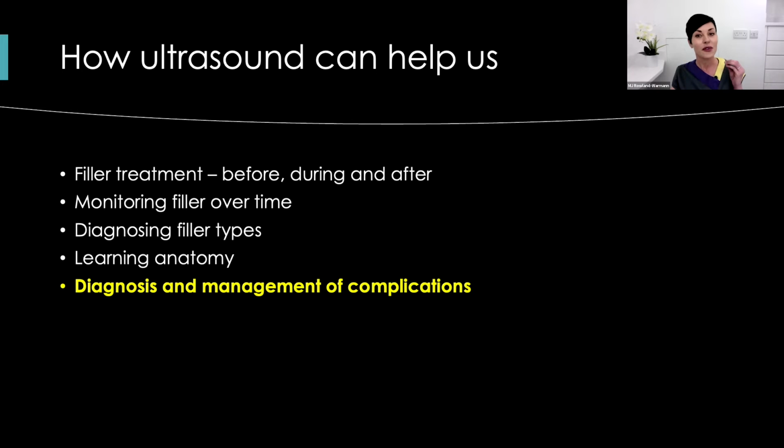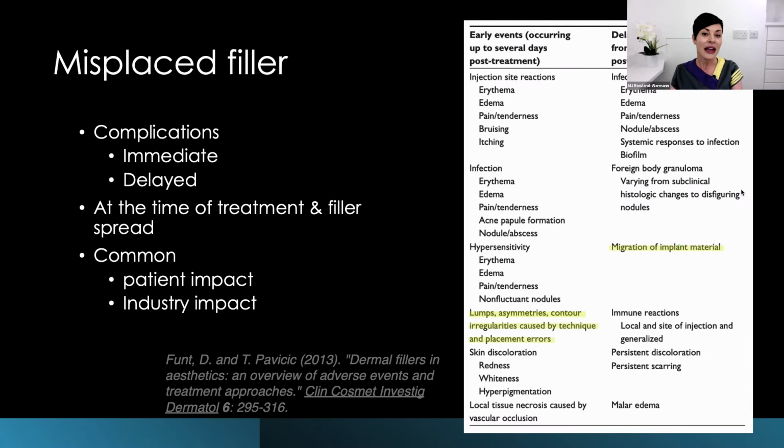Patients endure fewer interventions, less delays in diagnosing the problem, and the complication can often be found and fixed in the same session. And that's pretty wonderful. So complication management with the L20 is what I'm going to be talking to you about today. And specifically, we're going to be talking misplaced filler.